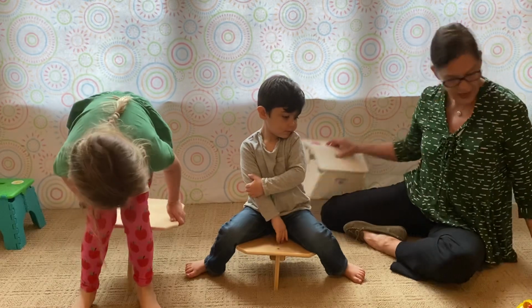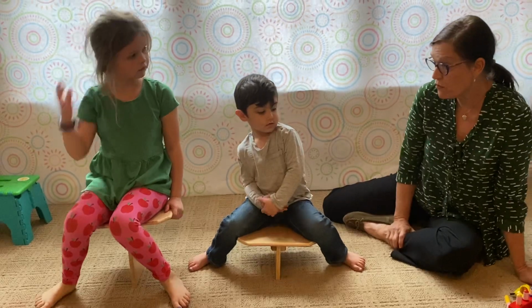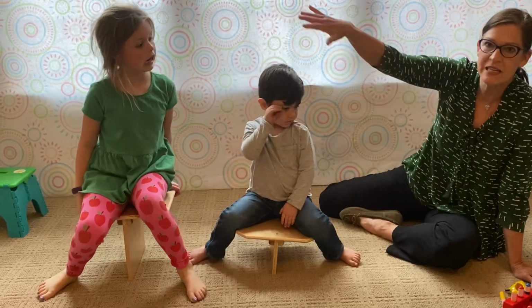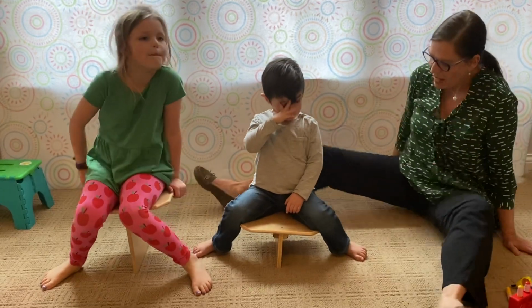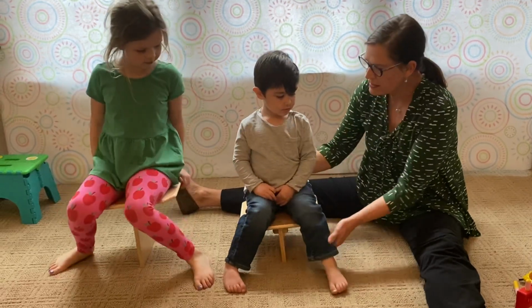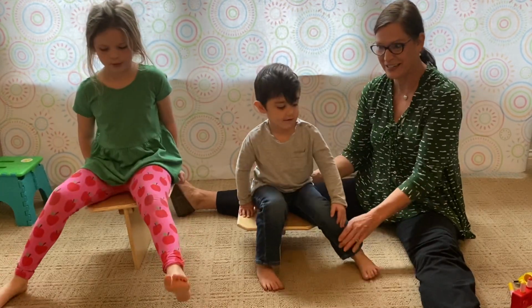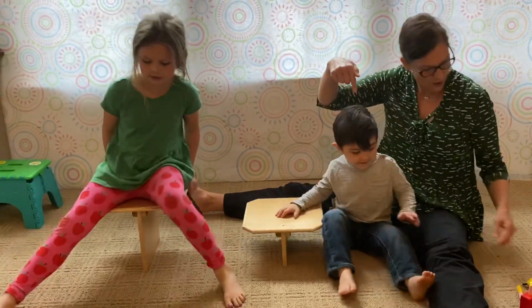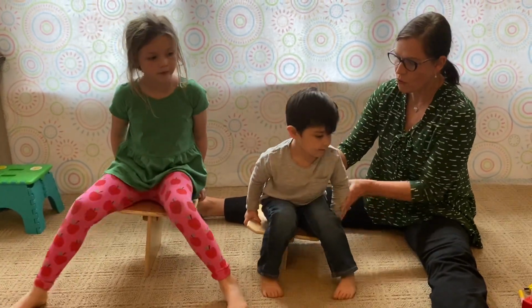The most important thing is to have it on a carpet because it won't slide. If it's on a smooth floor, it could slide very easily. And the second most important thing is to have anything that could be dangerous well away from them. Now, we talked to Ezra a couple of days ago about practicing, and one thing so that children aren't afraid of it is to practice sliding to the side. Ooh, he's already using nice protective extension before he was sliding to the side. And what we were looking for is some midline control and what's called head and trunk righting reactions.